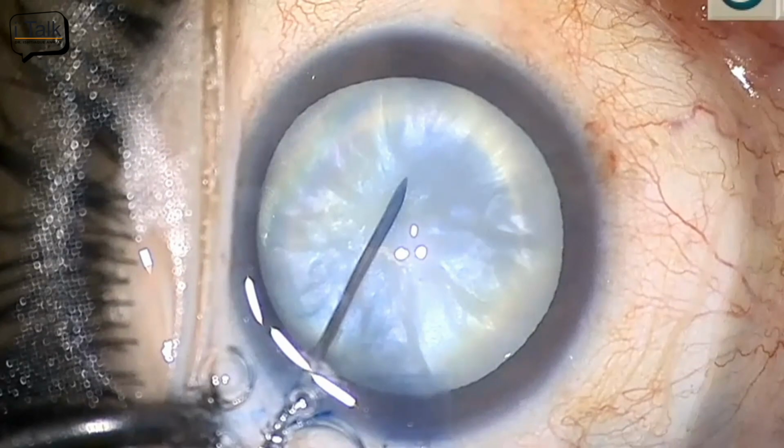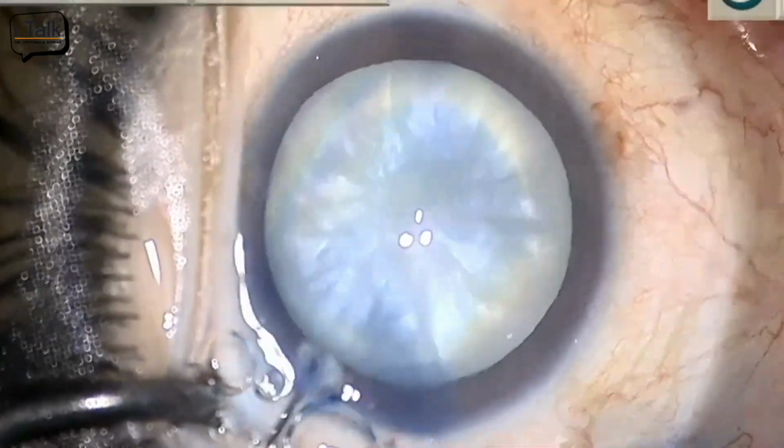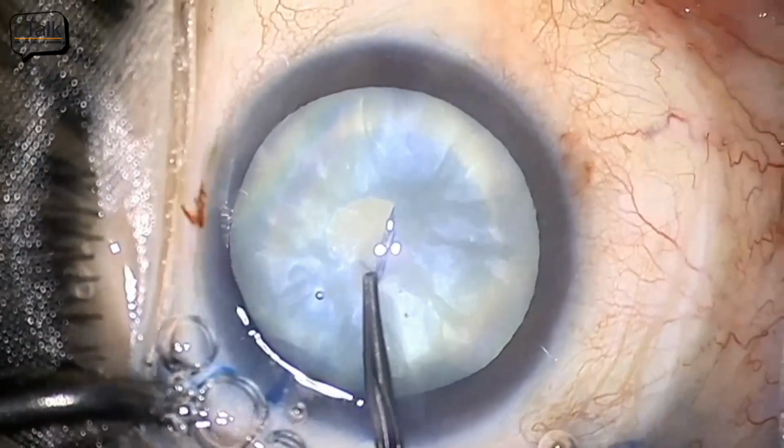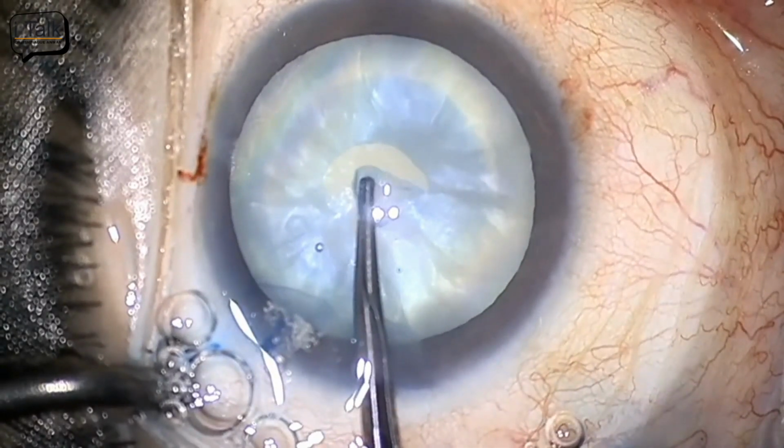Because if I find that it is highly liquefied, then I use a 30 gauge needle. But if I find that it may be slightly thicker, in these patients, I go in with a 26 gauge needle. And now what I'm doing is, the moment I enter, simultaneously, can you pause it? Simultaneously, I start aspirating the intralenticular fluid.